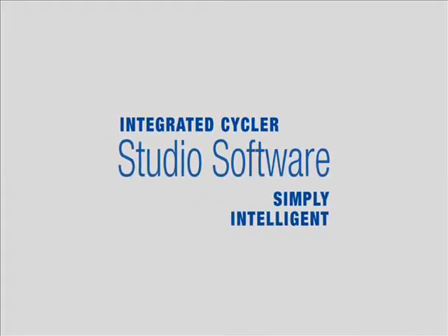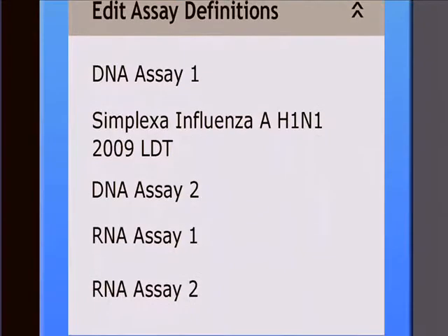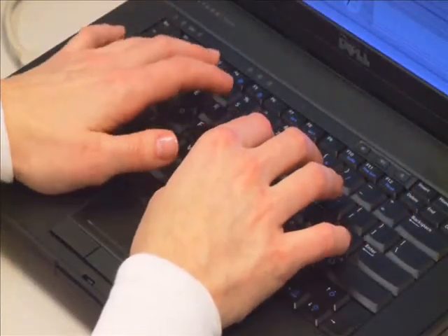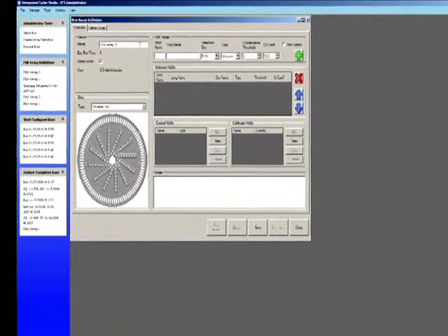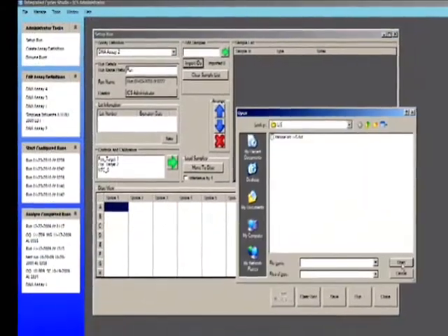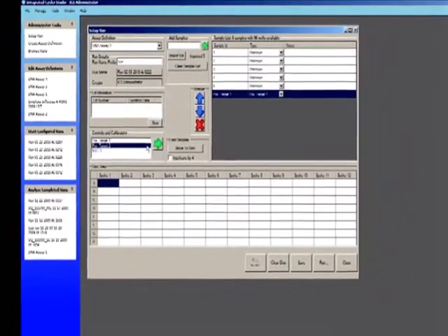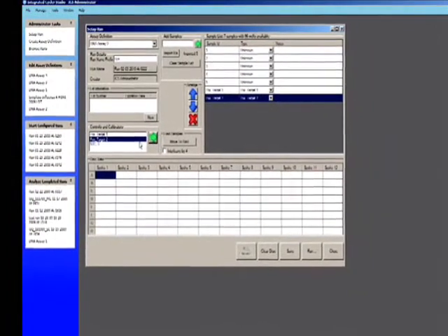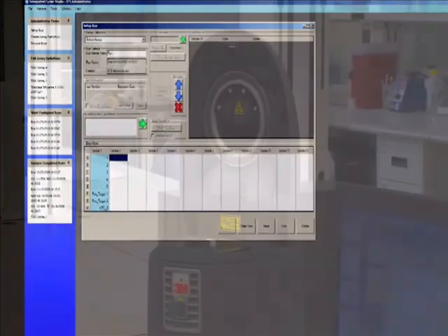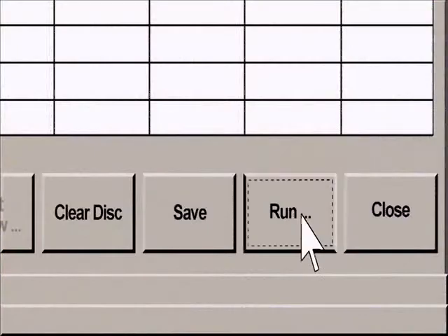The Integrated Cycler Studio software was designed by and for lab personnel and the lab setting. Commonly used features require just a single mouse click, allowing you to easily create assay definitions, test names, and input target, control, and calibrator information. Sample IDs may be easily and quickly loaded by using the included barcode scanner, or simply import them from a text file or enter manually. The software notifies users to make certain that appropriate controls are added during a run setup. Place the disk on the platen, shut the lid, and press run.